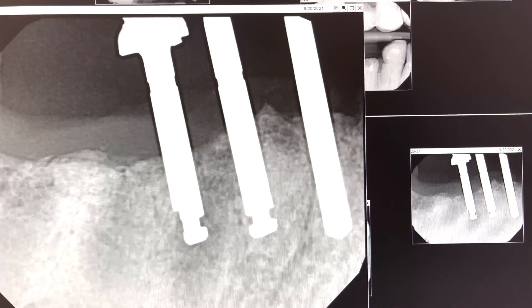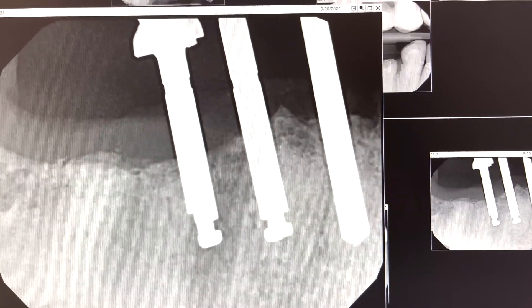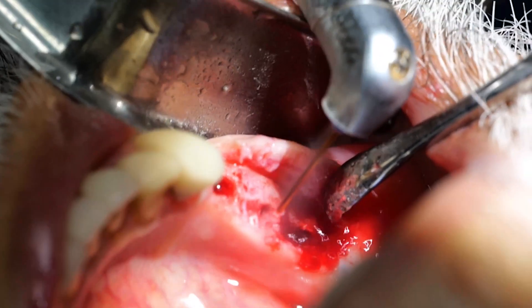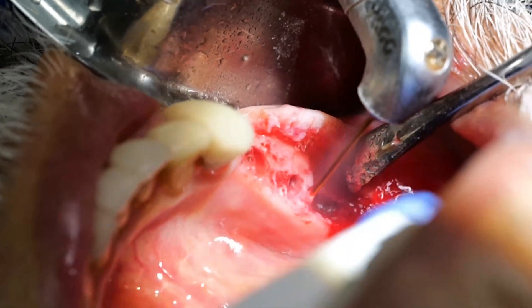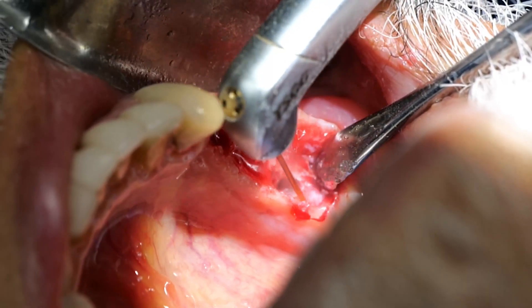I then have some leeway in making changes to the angulations, the depth, or distance between adjacent implants. Here I am using the water lays again to clean out and trim granulation or undesired tissue under the flaps.